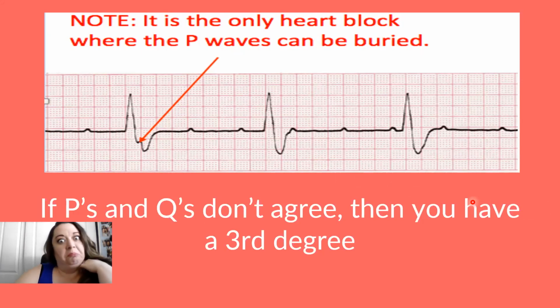So maybe that changed. But the deal here is that my P wave represents that my atria are firing. So if you look at this rhythm, if I go and look at all my P waves, I have a P wave here, there should be one here, and there's kind of a weird bump. So maybe that's it. All my P waves march out. And if you look at their rate, this is 1, 2, 3, 4, 5, 6, 7, 8, 9.